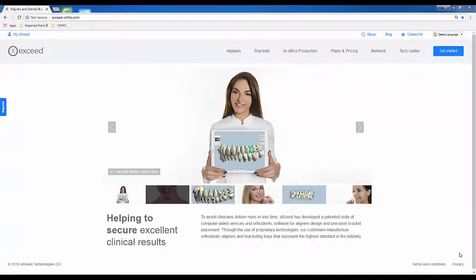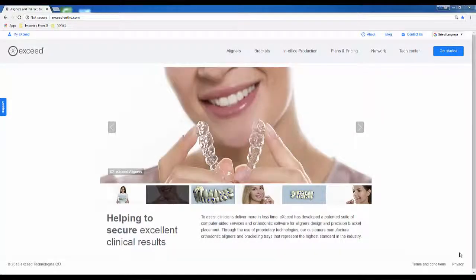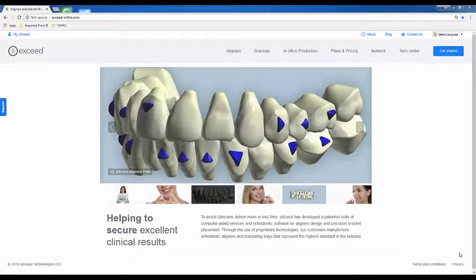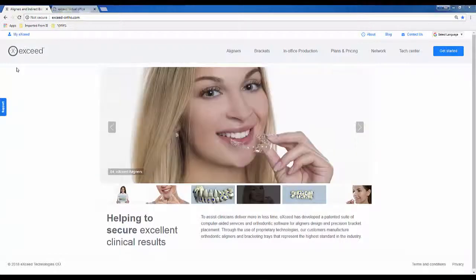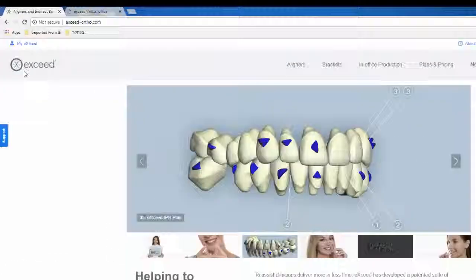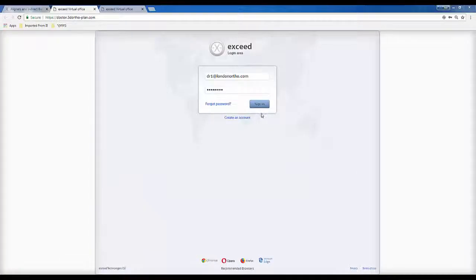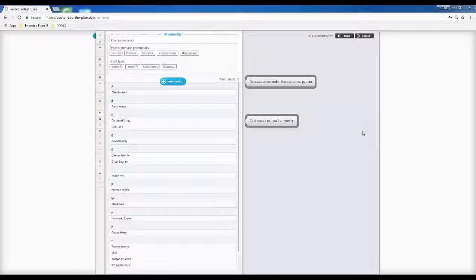Welcome. In this video, we will discuss how to submit and manage EXCEED order. First, log in to the EXCEED account to view the patient's list.